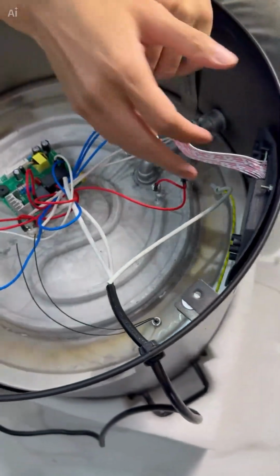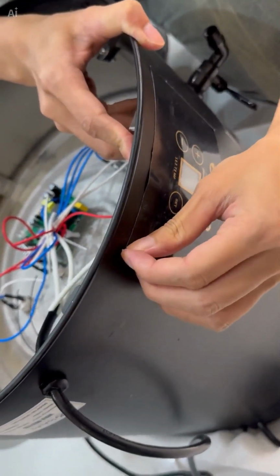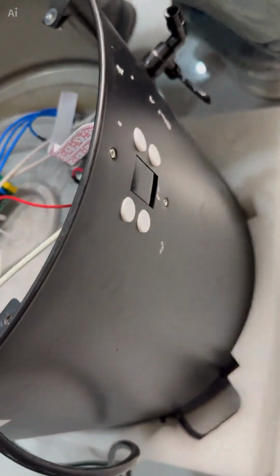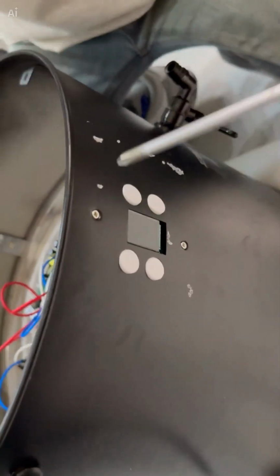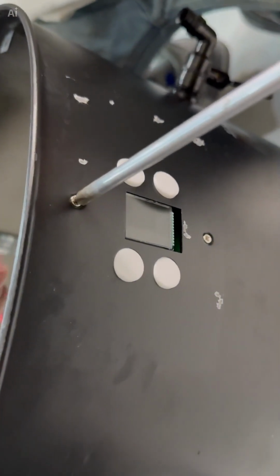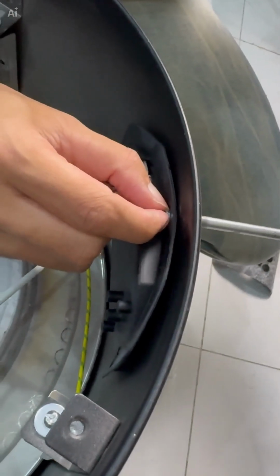Then the next step is to peel off this surface sticker. Then take a screwdriver and first remove these 2 Phillips screws. When disassembling, you may need to pay attention to the back. You may need to hold this nut by hand and then loosen it.